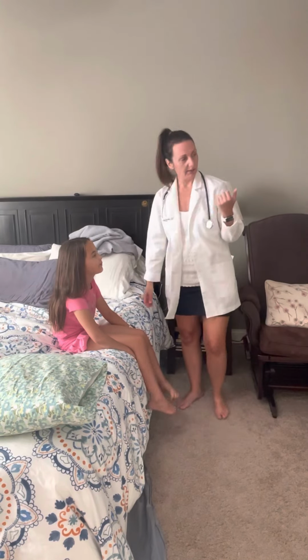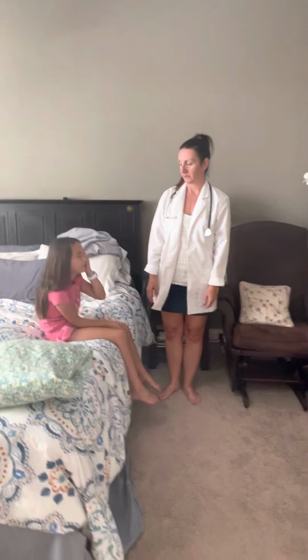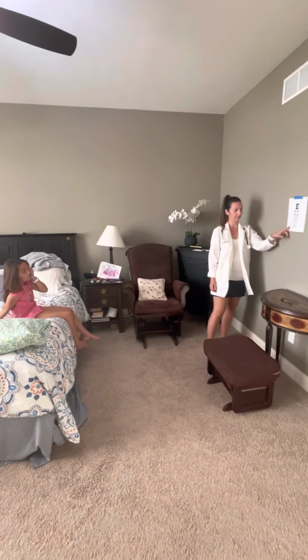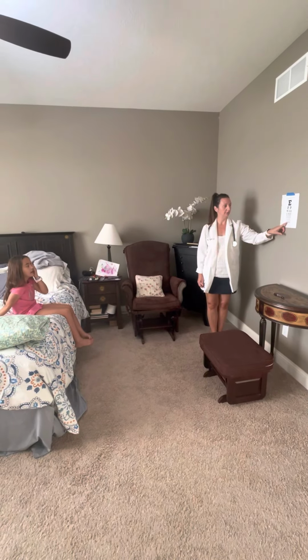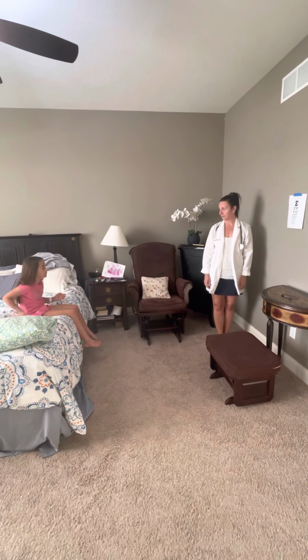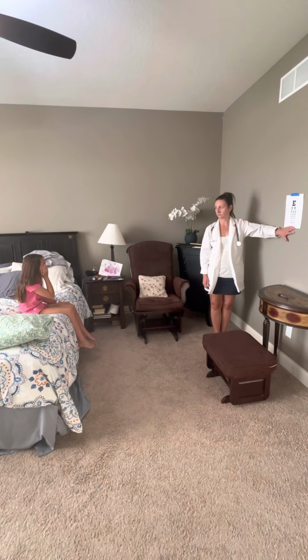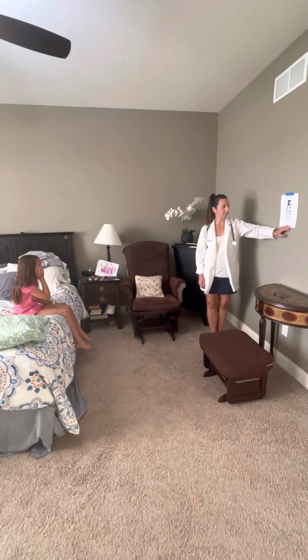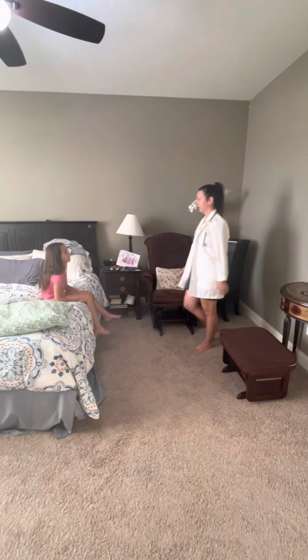And then I'm going to have you cover your eye. Yep, that's fine. And your right eye, go ahead and just read this line, the 20/20 line. So this line. D-E-F-P-O-T-E-C. Great. Now cover your other eye. Yep, and read that line again. The one below. No, this same one. D-E-F-P-O-T-E-C. Very good.